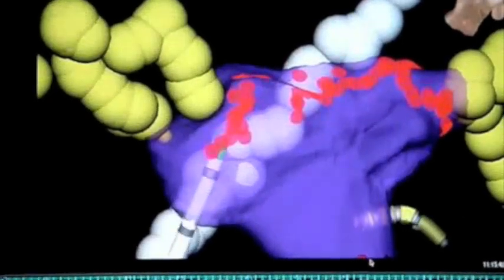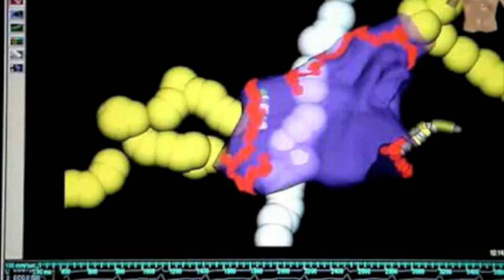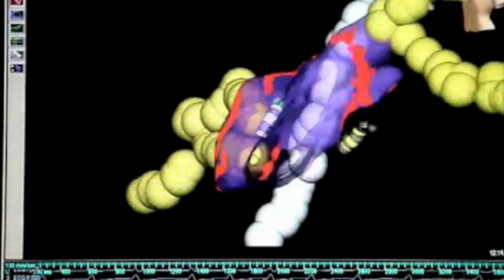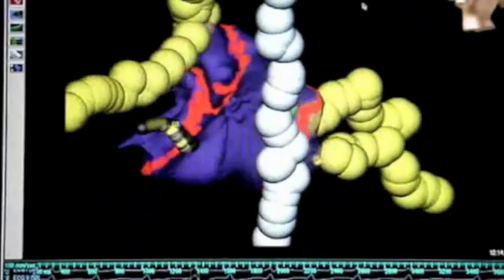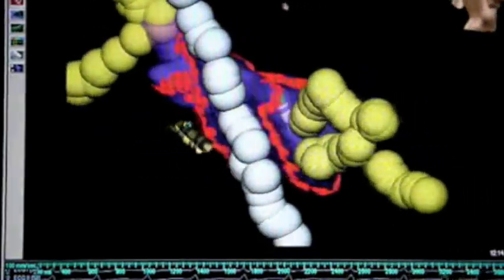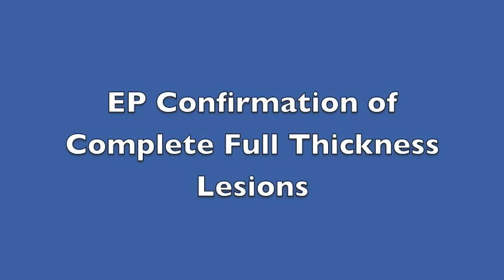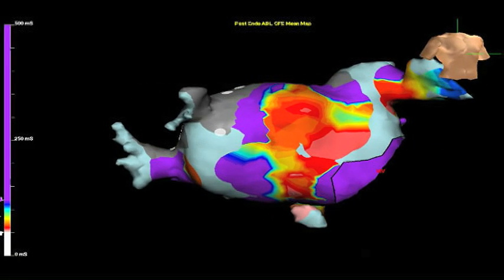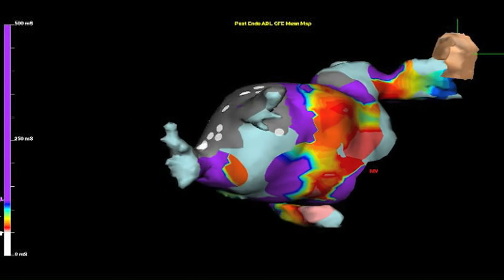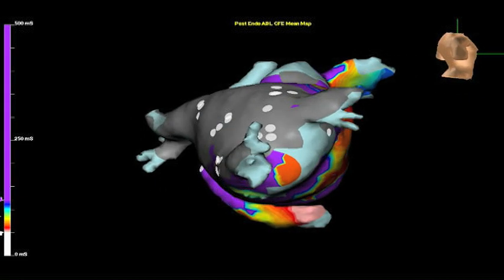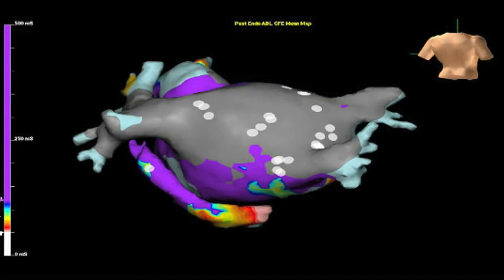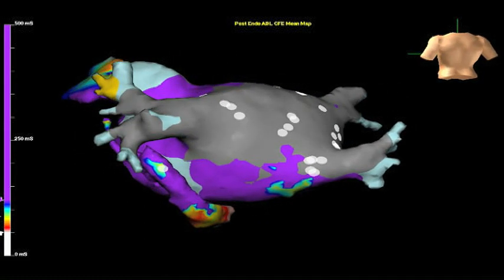Once we complete the radiofrequency, we're able to go about in a very systematic manner and confirm the complete full-thickness lesions and assess for full block from the pulmonary veins. With this, we ensure that we've performed an optimal procedure for this complex arrhythmia patient.